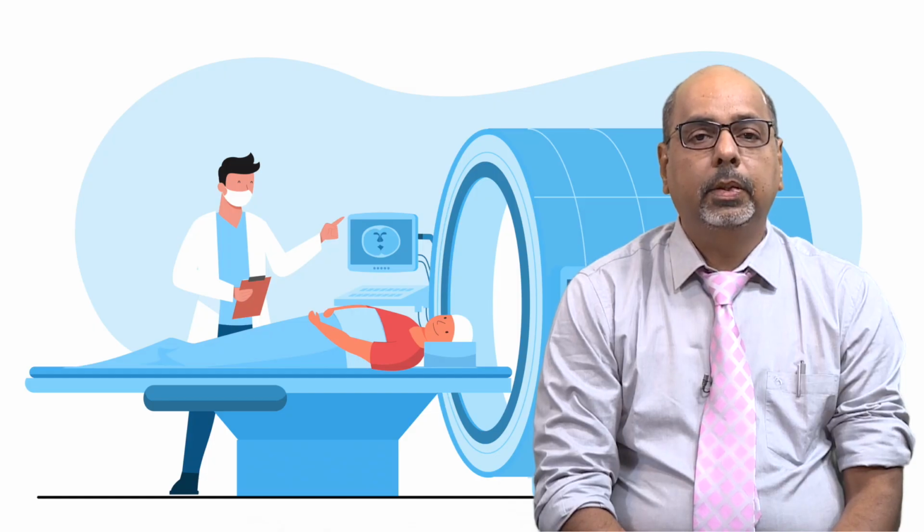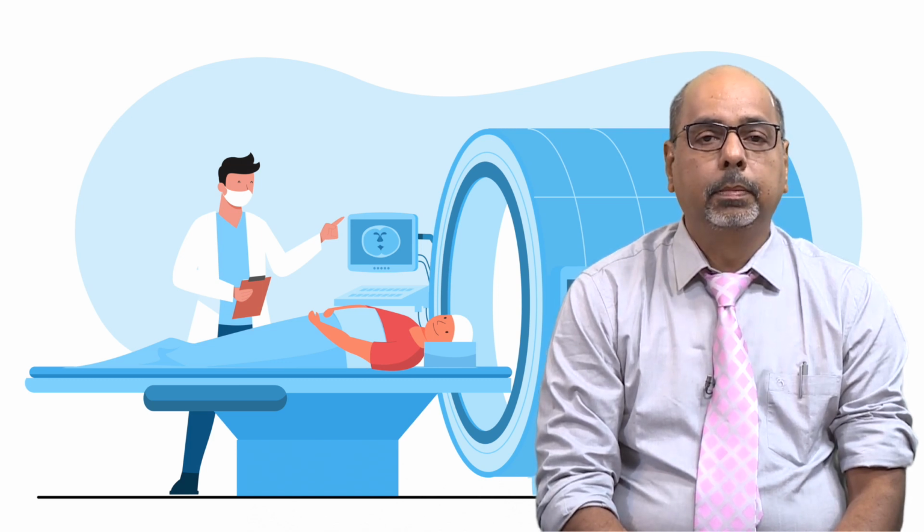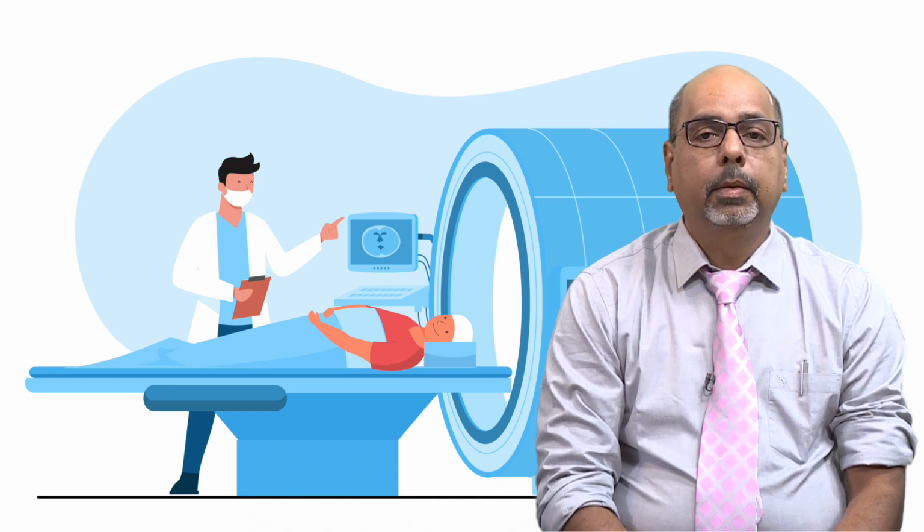First of all, we will start with introduction of MRI. Here we will see MRI as a form of scan, a non-invasive and painless procedure to provide precise images of the body's internal organs and tissues. A thorough cross-sectional image of interior organs and structures is produced by an MRI scan using a powerful magnet, radio waves and a computer. Then we will see why we need an MRI scan.